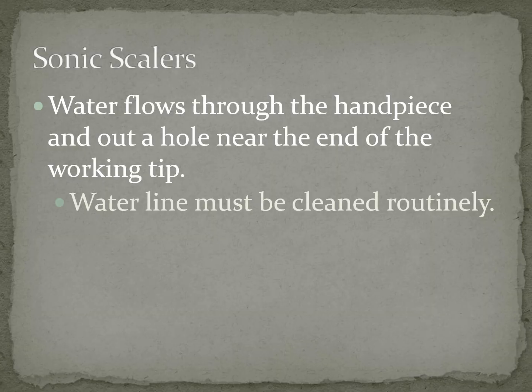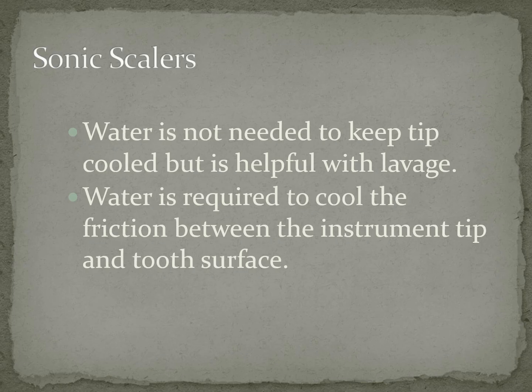And the water flow is going to be through the handpiece, and it's going to come out a hole near the end of the working tip. And obviously we need to make sure that our lines are clean, but we do that here in clinic, right? We dry our lines every night, and we make sure that we keep our biofilms down to a minimum. So for these, water is not going to be needed to keep the tip cool, but it's going to help with lavage. Now, lavage just simply means the water that's coming out is going to flush. It's going to rinse out the area.